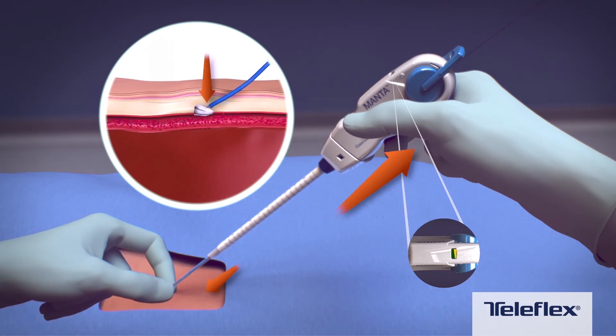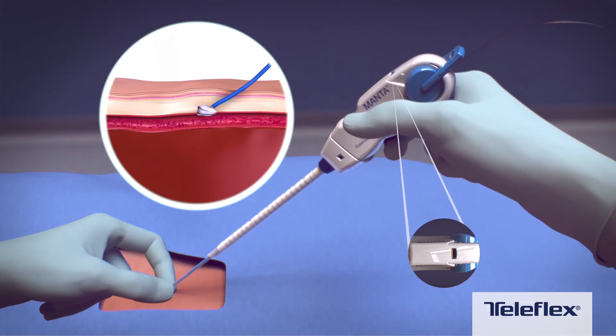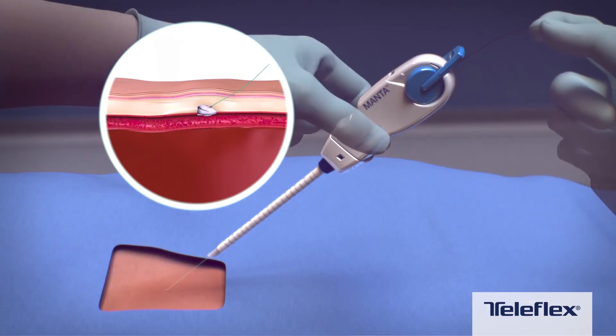Maintaining this yellow-green tension, gently advance the lock advancement tube to position the radio-opaque lock. While stabilizing the vessel with the lock advancement tube, retract the device slightly until a click is heard. The access site is now sealed. The lock advancement tube may be retracted to assess hemostasis.